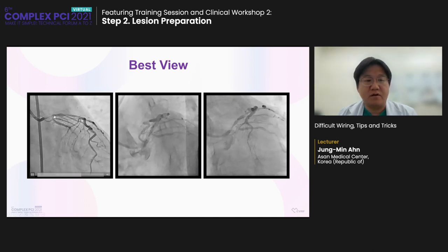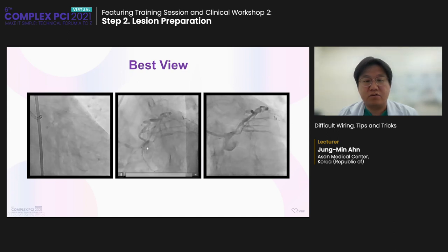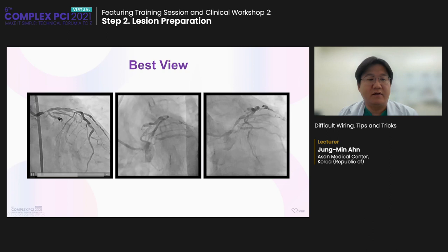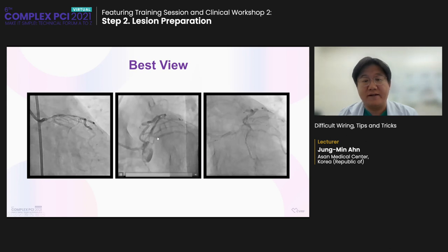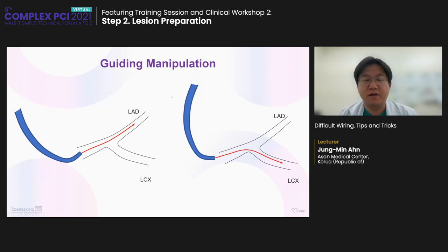To cross the circumflex in this kind of case, the best view selection is very important. I like to select the spider view rather than the caudal view because the spider view better visualizes the circumflex ostium. So selection of the best view is very important.